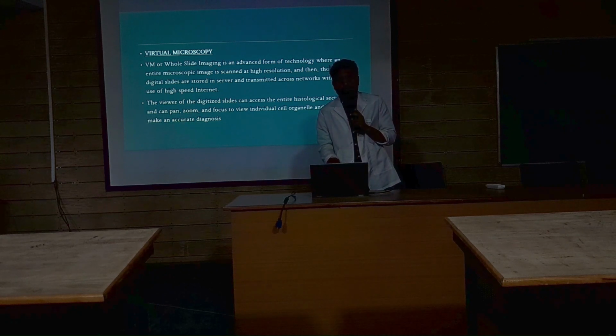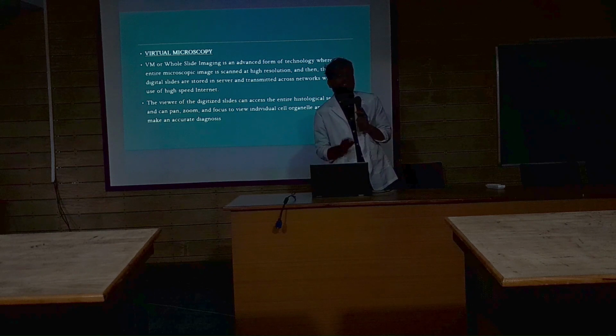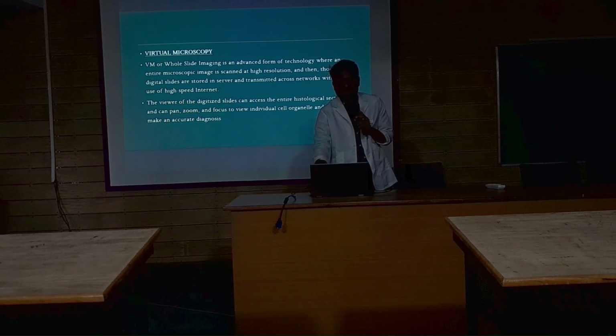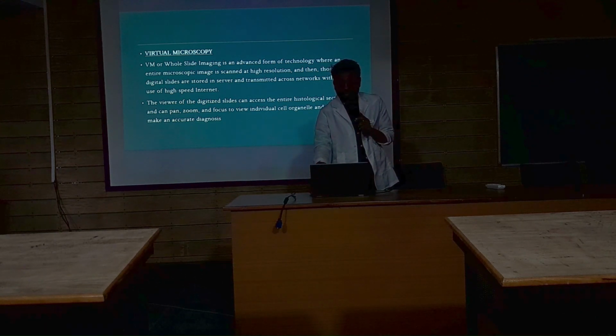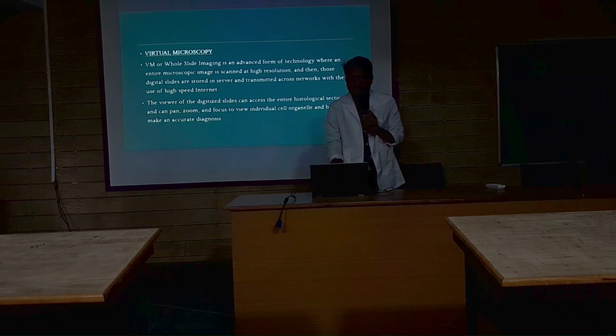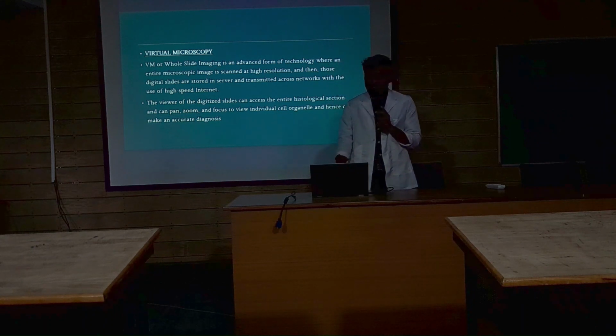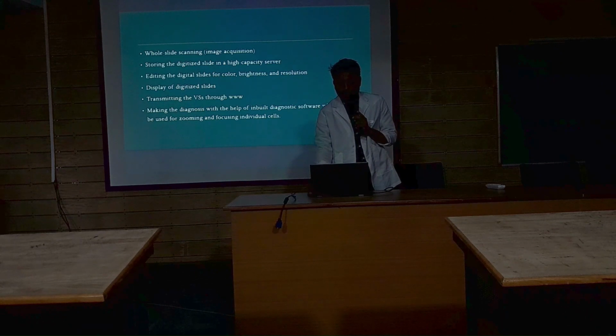Now with virtual microscopy, we scan the whole slide and upload it into a software, and then from different places, different pathologists can view the slide and help in diagnosis. The viewer of the digitized slide can access the entire histological section and can pan, zoom and focus to view individual cell organelles, and hence can make an accurate diagnosis.